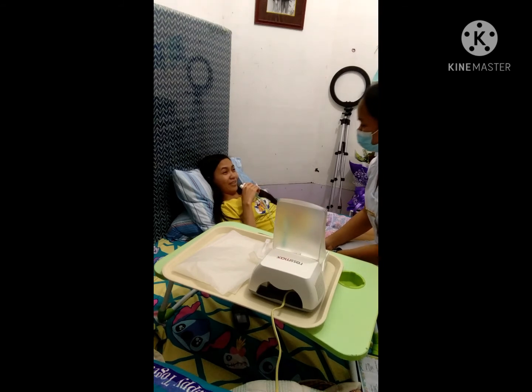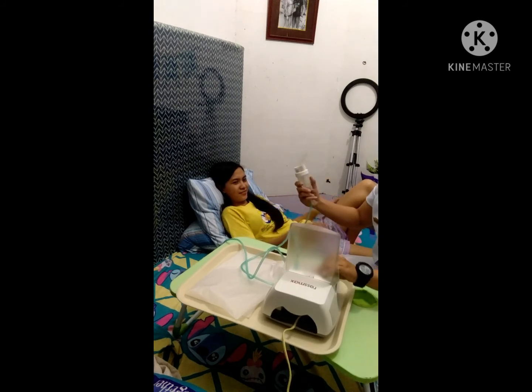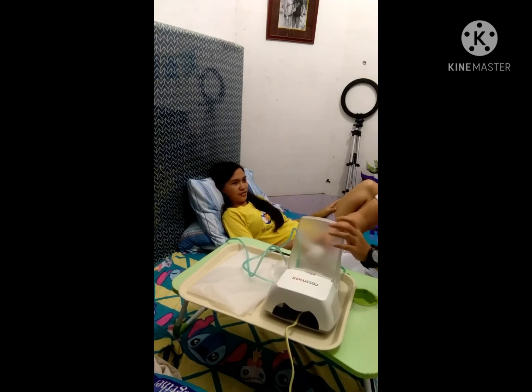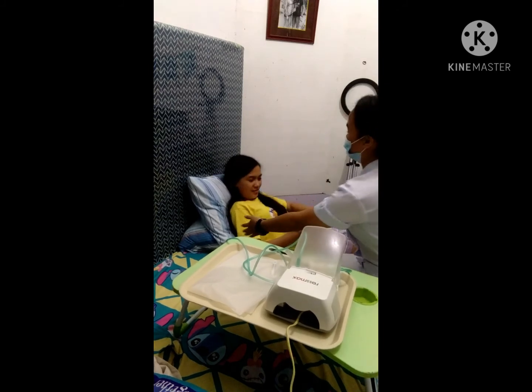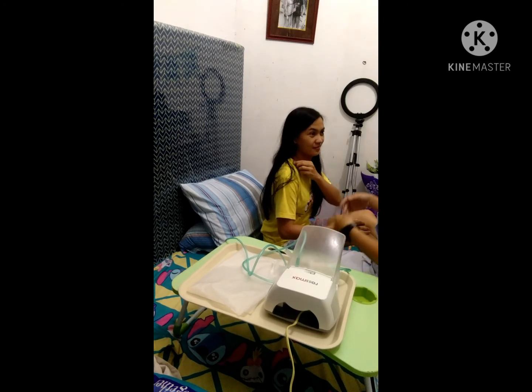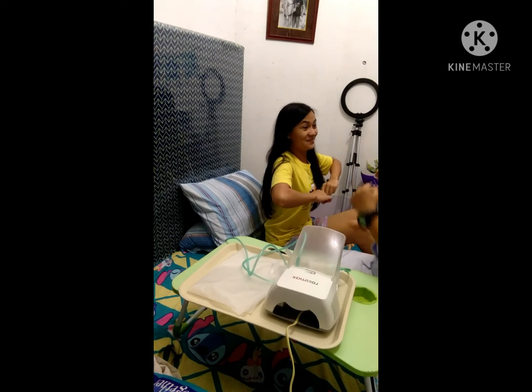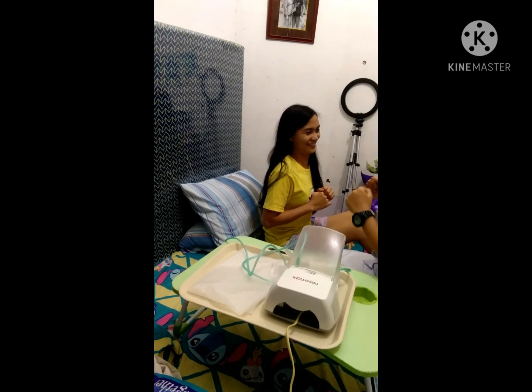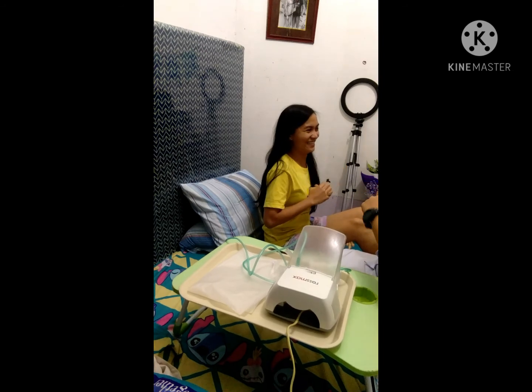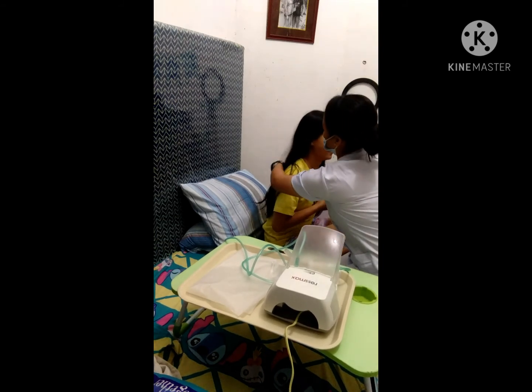Remain with the patient until all the solution has been nebulized. Instruct the client to continue the treatment until he or she can no longer see a mist on exhalation. The medication may help to loosen the bronchial secretions, thus encourage the patient to expectorate. You can do expectoration exercises or percussion at the client's back.